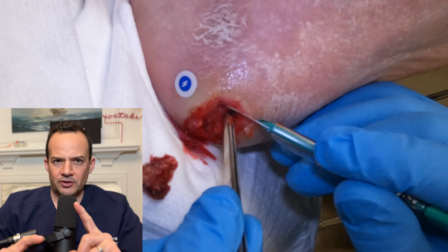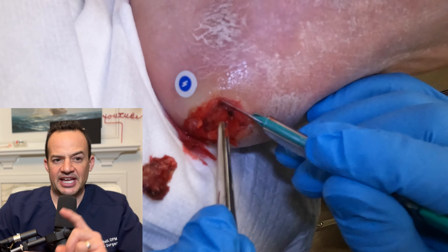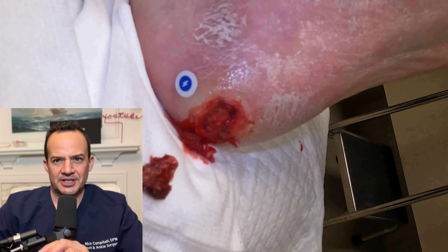You're probably wondering what that blue dot or lightning bolt on the side is — that is a reference point so that when our staff uses a camera to take a picture, it automatically measures the wound.